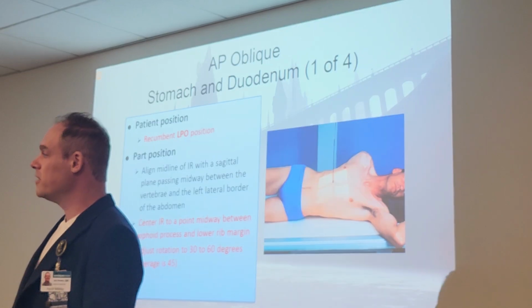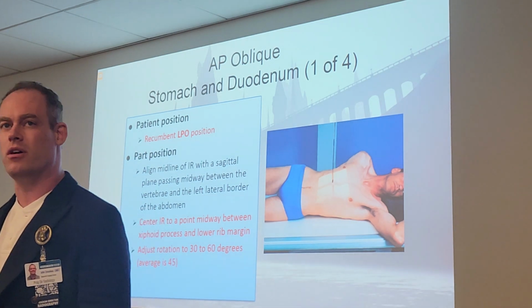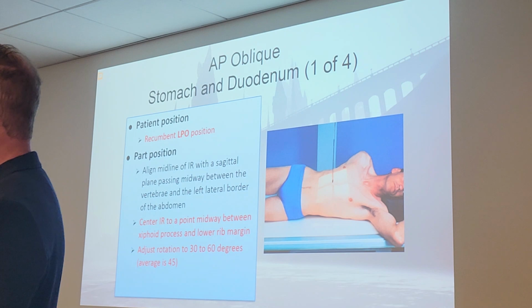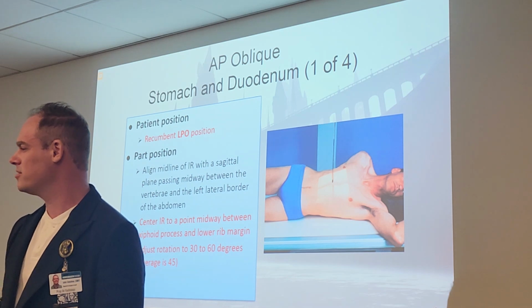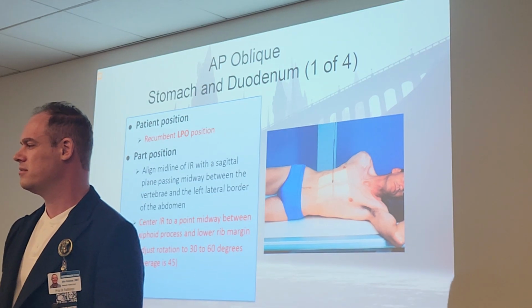Okay, let's talk about the other oblique. We're going to talk about the LPO. It's got a unique oblique, being that it's LPO only. Our centering is a little bit different. We're going to be between the xiphoid process and the lower rib margin. It should sound kind of familiar to something else. Y'all have used that before.